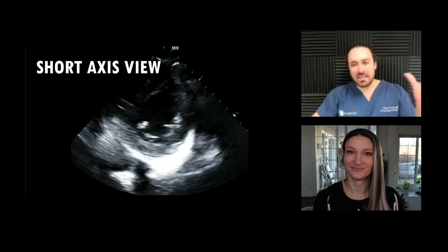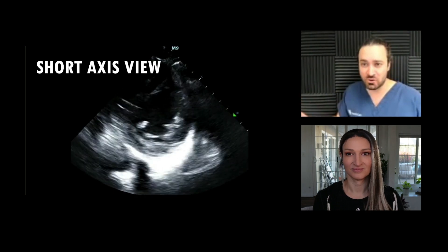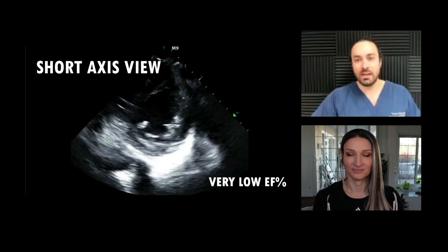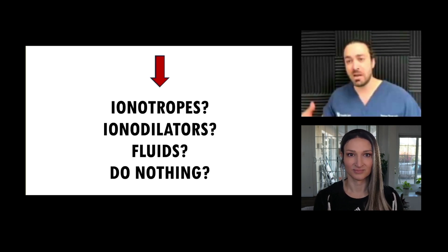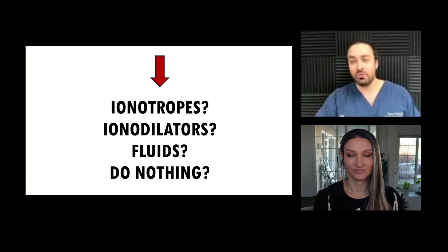That's EF, which is okay. A lot of people out in the world have low EFs and they're at the grocery store right now. It's probably because their stroke volume is compensated. We say very low EF. And the question is, what kind of shock is this? And of course, what am I doing for my patient? That may mean inotropes, it may mean dilators, right? If they're in RV failure or something like that, do they need fluids or do I need to do nothing? That's how I'm going to help decide what to do with this patient.